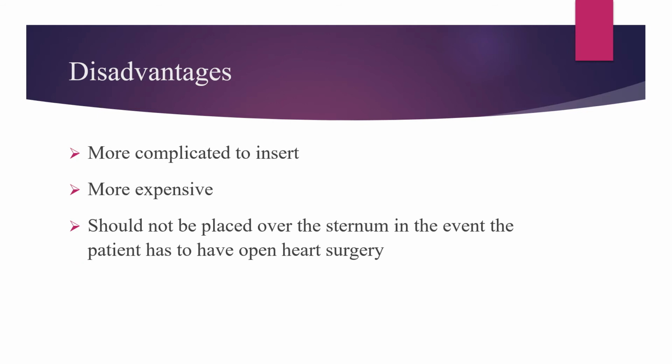The disadvantages are that it is more complicated to insert the catheter and more expensive, and it should not be placed over the sternum in the event that the patient has to have open heart surgery.